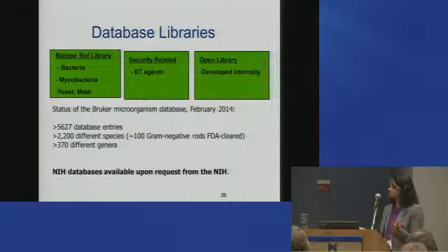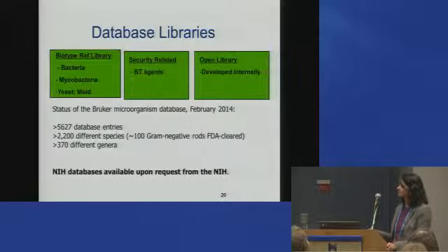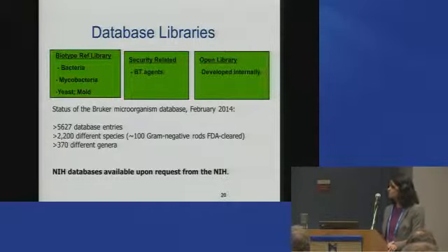And then once we had this repertoire of organisms, we systematically did sequencing and we did the spectra on these organisms and we stored them for our own databases. So it is really, really nice because when you're querying these organisms on the database, you can query all of these different libraries all at the same time, okay? So it tells you if it found a good match or not, and so on.